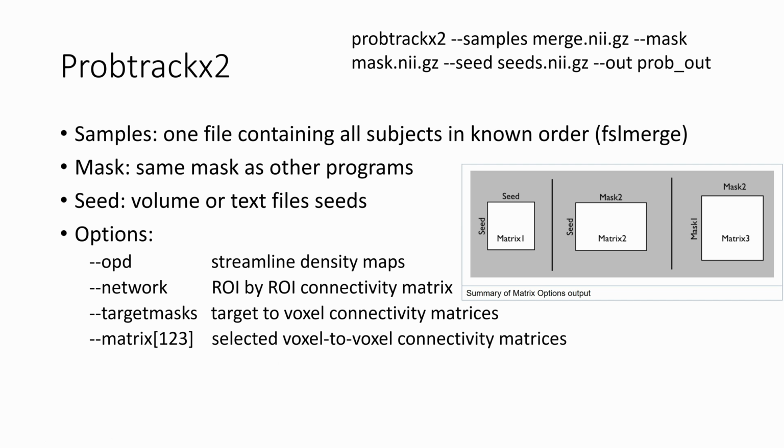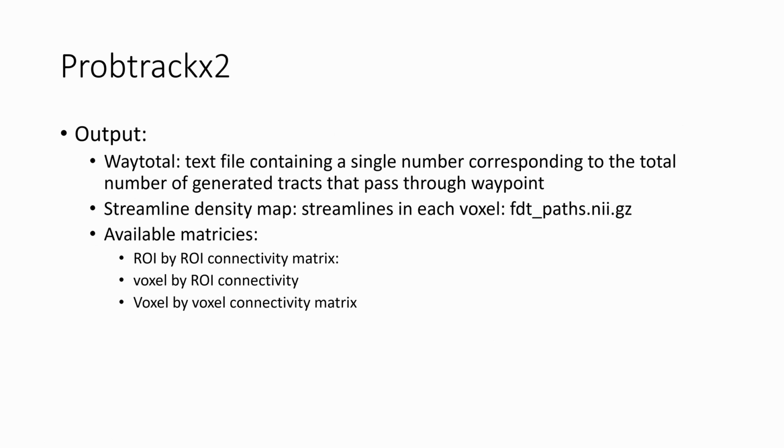I take no offense. So, probtrack is the next step of, okay, what do you do with that? Now that you've got this idea of a roadmap of a brain about where all the white matter's going, you can build up networks, you can build up targets, and you can create seeded and masked data sets to work out how connected various spots are. You can put in a whole brain mask and map between all these different locations, and work out the strength of it, how many paths you have connecting through, and which ones are connecting to each other.